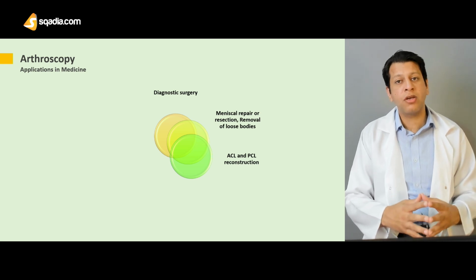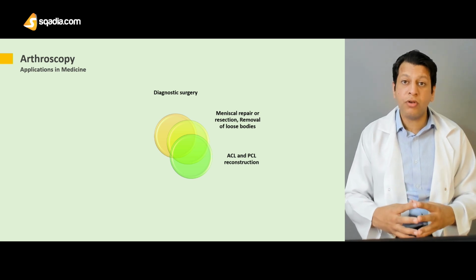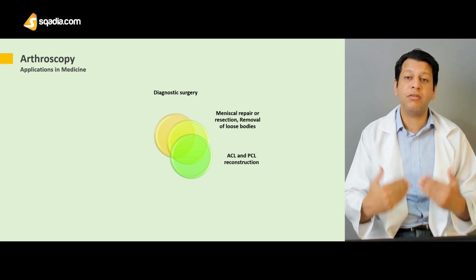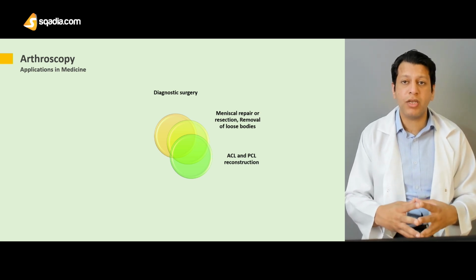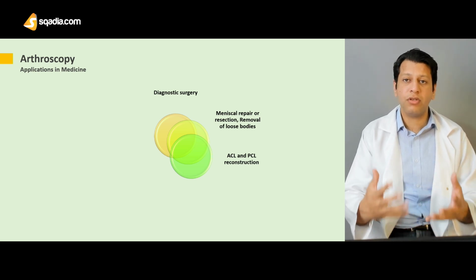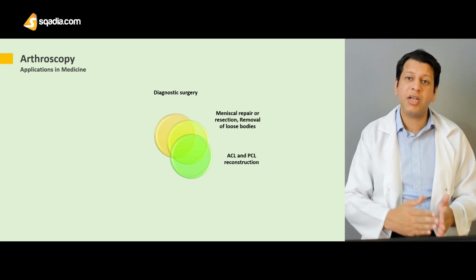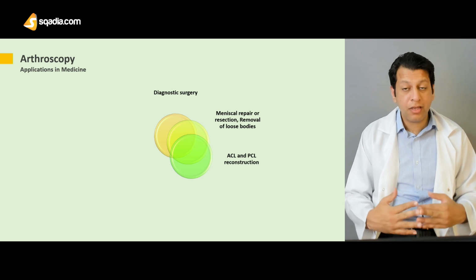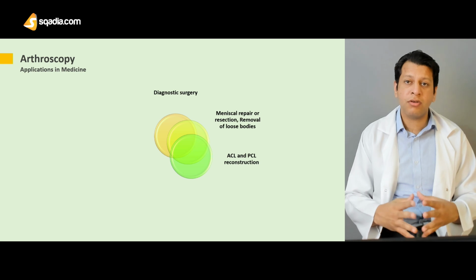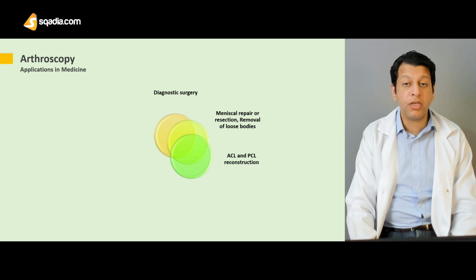Although it has a long learning curve. Initially, it takes a lot of time to learn arthroscopy, and just by doing the diagnostic arthroscopy, then a surgeon actually shifts forward to doing some part of the ACL reconstruction, and eventually will be doing the complete procedure all by himself. Although it has a steep learning curve, nowadays ACL PCL reconstructions totally by arthroscopy is very much possible and routinely done.